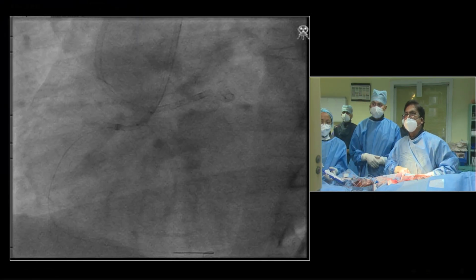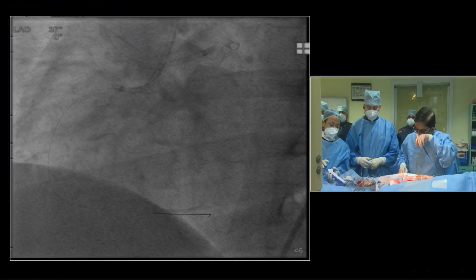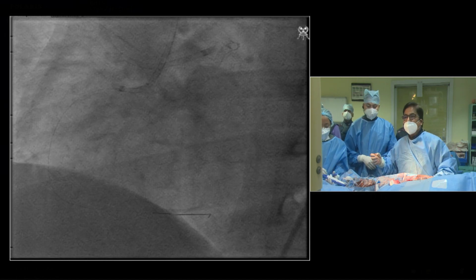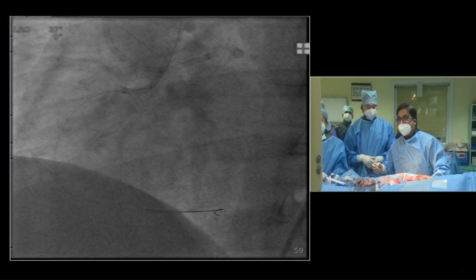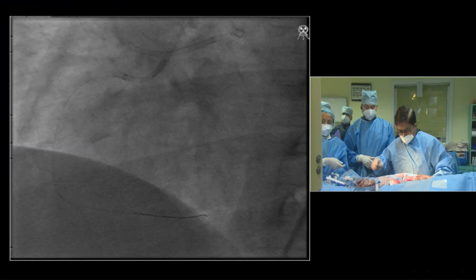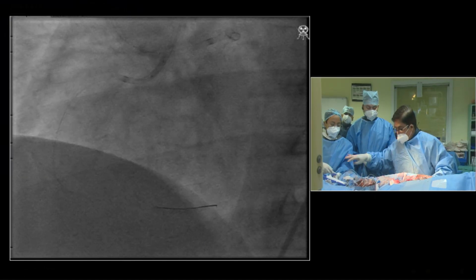When the second wire crossed, even Dr. Pratap understood the wire is in the distal lumen, but as an operator, Dr. Goel was telling, let me see. Yeah, because I have seen these wires go haywire. I know that he will not agree till he sees it by himself by angiography. Seeing is believing, I believe in that statement.